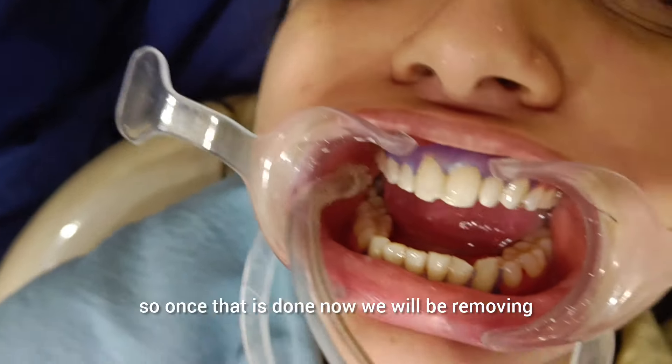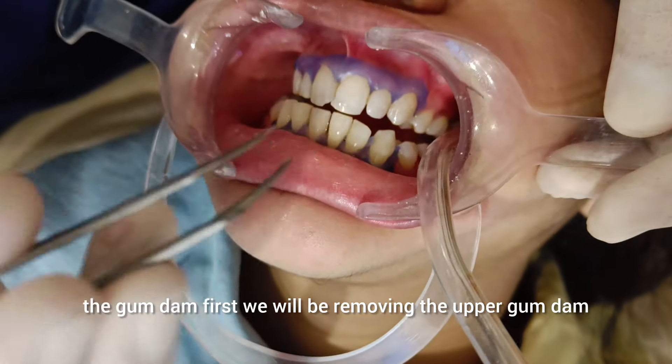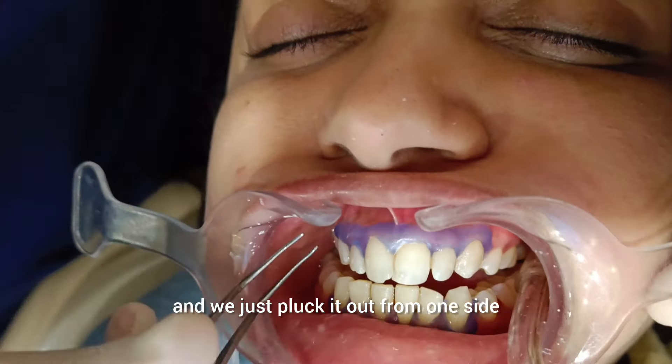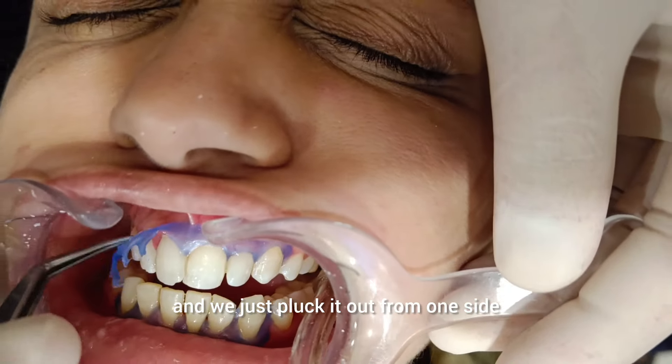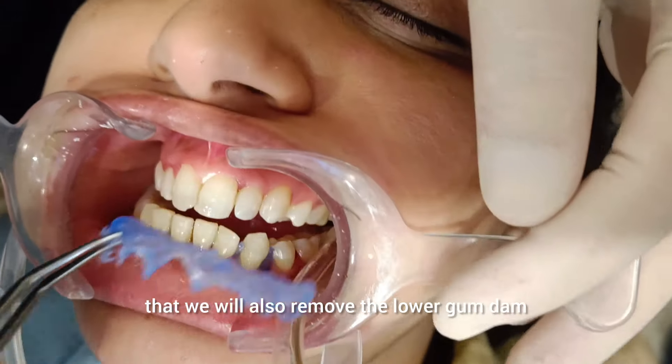Once that is done, we will be removing the gum dam. First, we will be removing the upper gum dam — we just pluck it out from one side and it will just peel off. After that, we will also remove the lower gum dam.